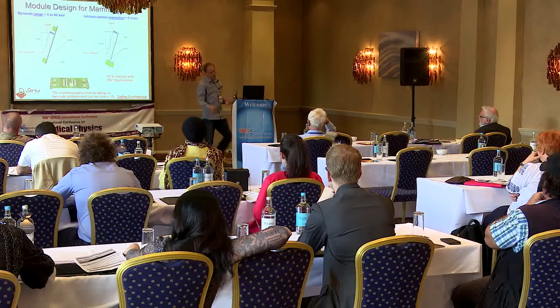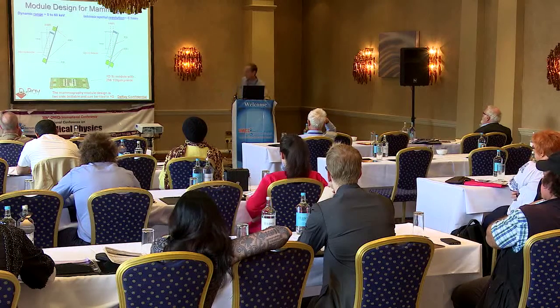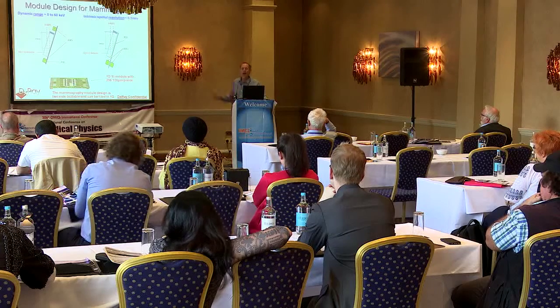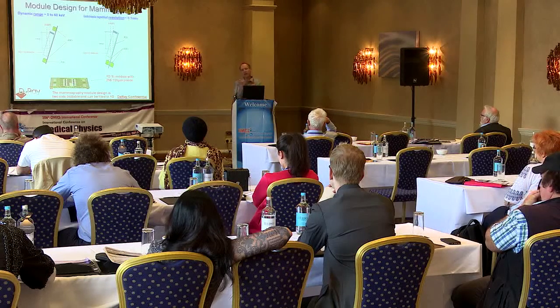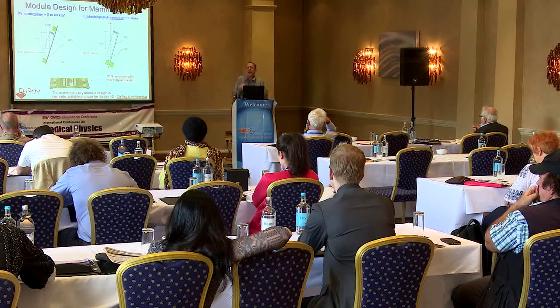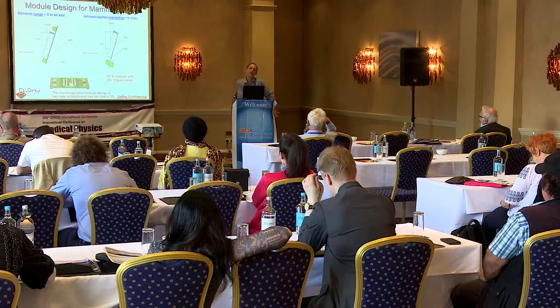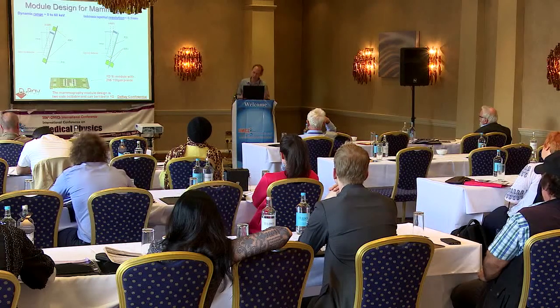Philips introduced into the clinic last year the first spectral photon counting system. Well, no, they introduced a photon counting system by using a similar method with a single energy bin. So this cannot do this multiple energy imaging and the nanoparticle imaging that I've been talking about. It has just the single advantage of eliminating dark noise from the image. And so it counts photons but doesn't measure their energy.